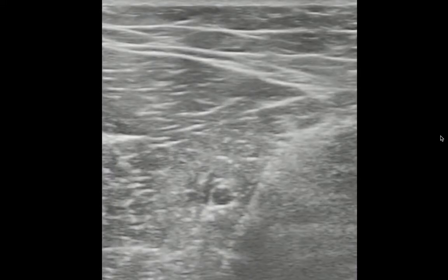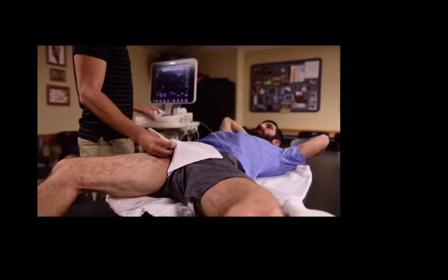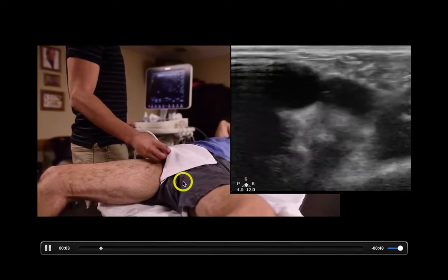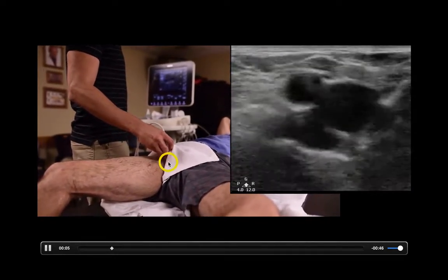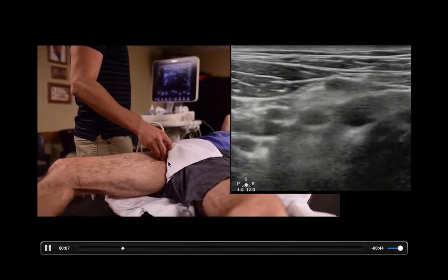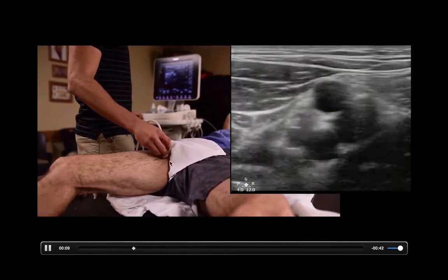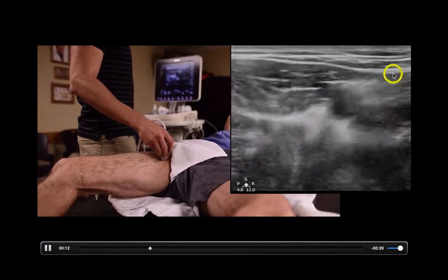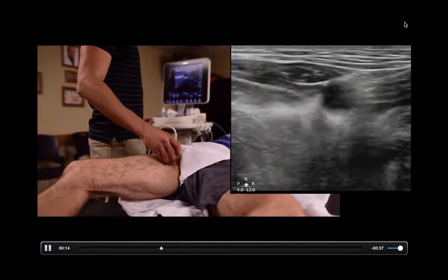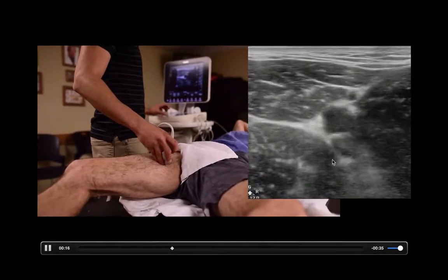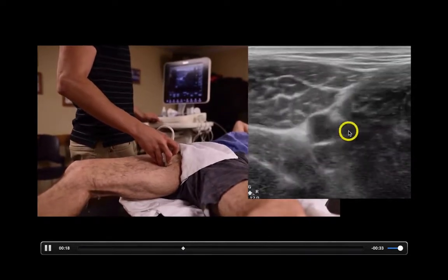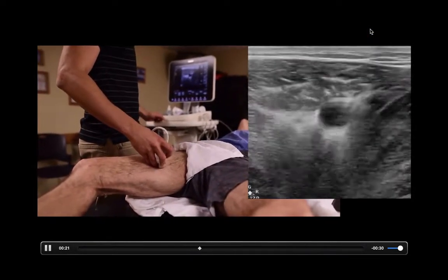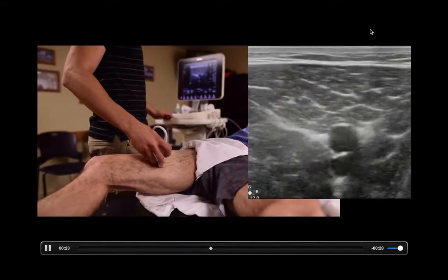So you want to see what that actually looks like when you're doing it on an individual. Right here you have the common femoral vein, and you'll see I'll track it down and I'm compressing at one centimeter increments. So every centimeter you lift and then come down and make sure that those walls are touching. This is compression ultrasonography. And if you're able to compress the walls of that vein — you see that right there — I'm able to compress the walls of that vein.